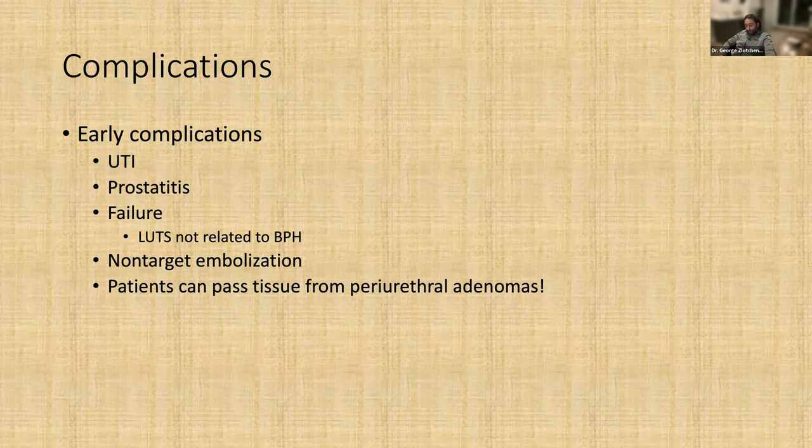I got a call early on from a patient who was very freaked out because he did have hematospermia, and I failed to mention that that was part of what can happen.